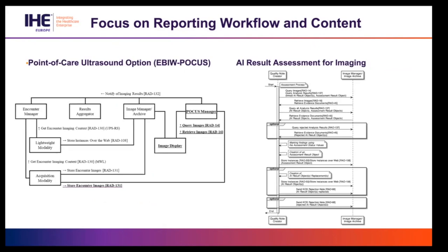The extension of the AI results profile, not even the extension, but rather the augmentation of that with additional functions and use cases, is the AI results assessment for imaging profile, which is currently in public comment, or will be in public comment in about a week.